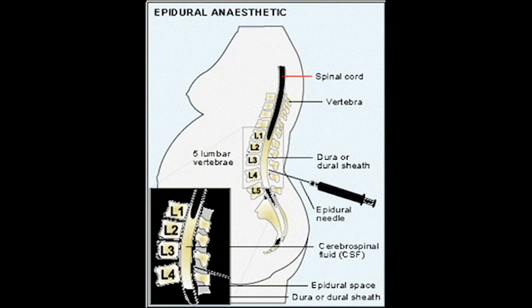Epidural anesthesia is a type of neuraxial anesthesia. It is commonly used during labor and for pain control during and after surgery. It requires a larger dose of local anesthetic compared to a spinal anesthetic. Epidural catheters can be placed in all three regions of the vertebrae as well as the caudal region.